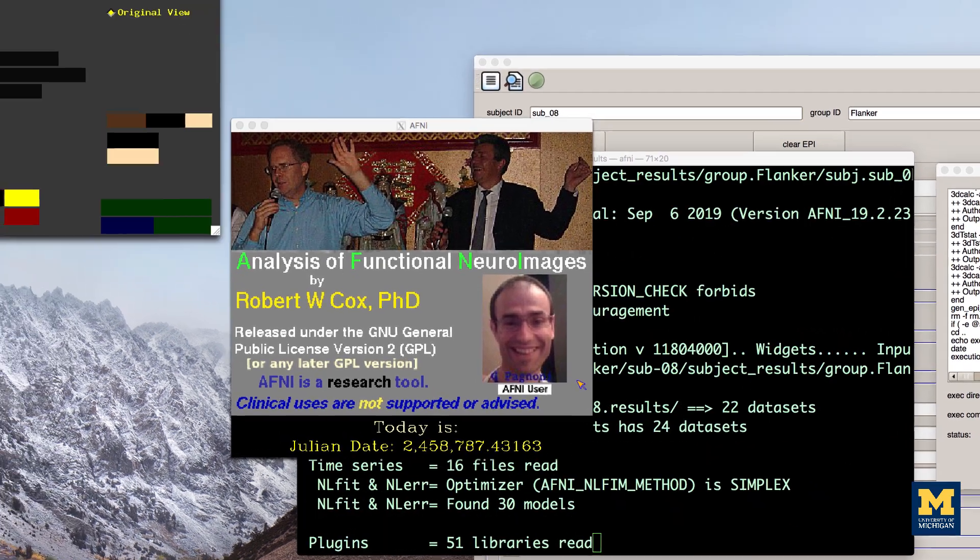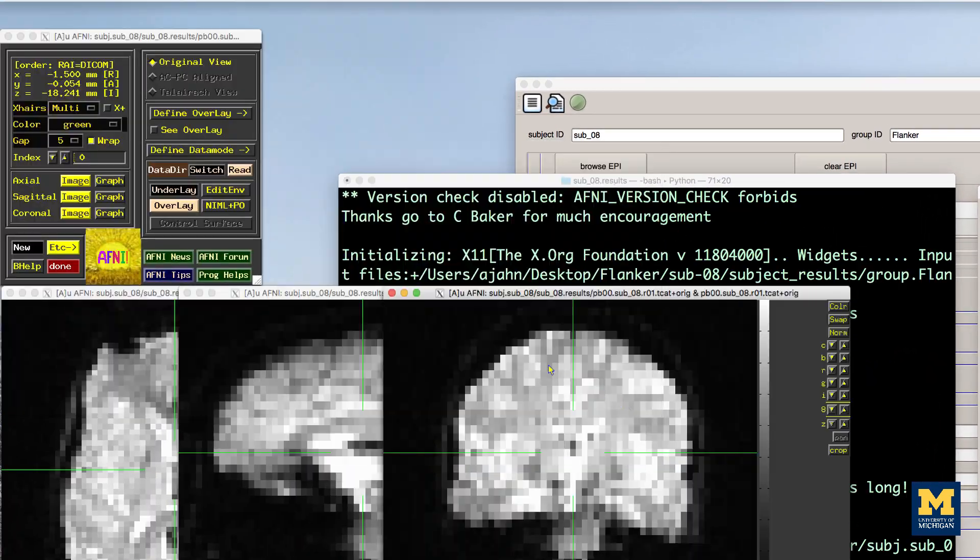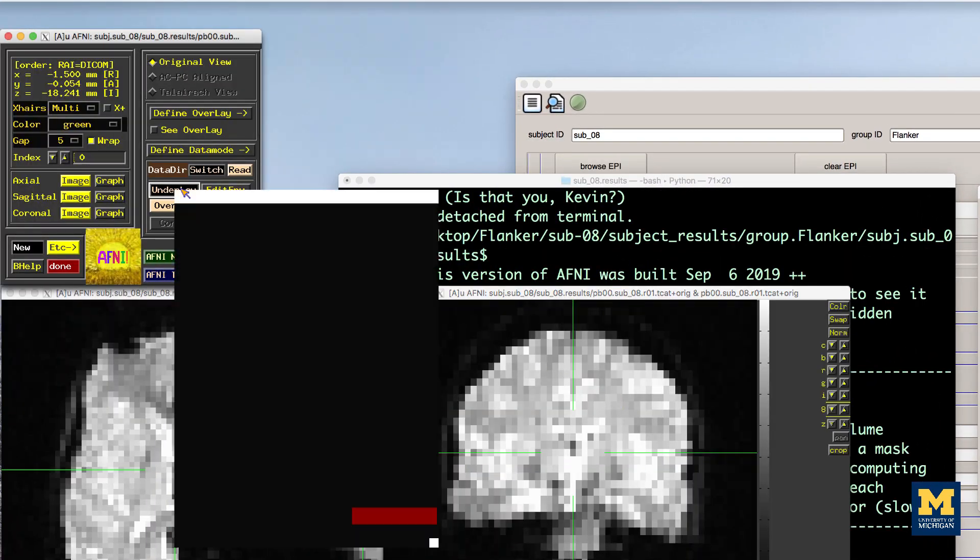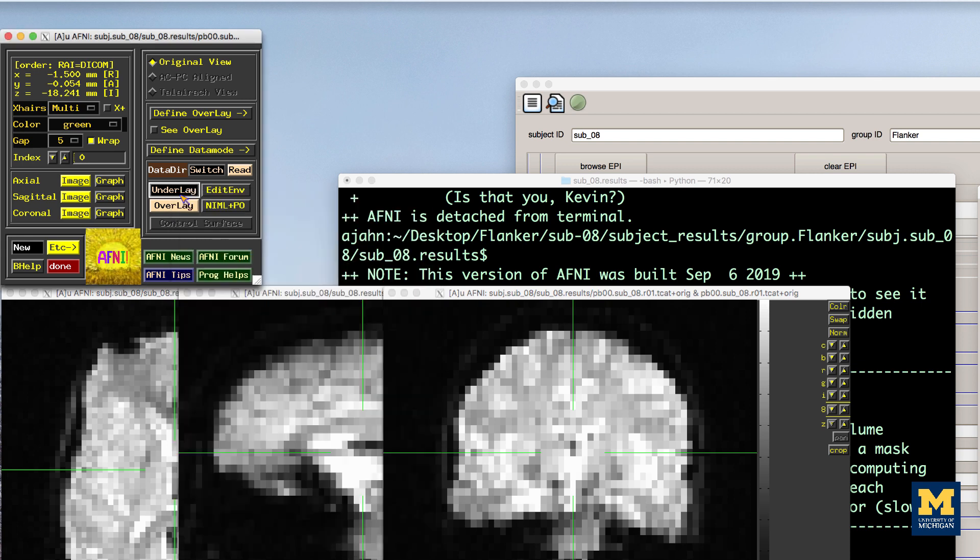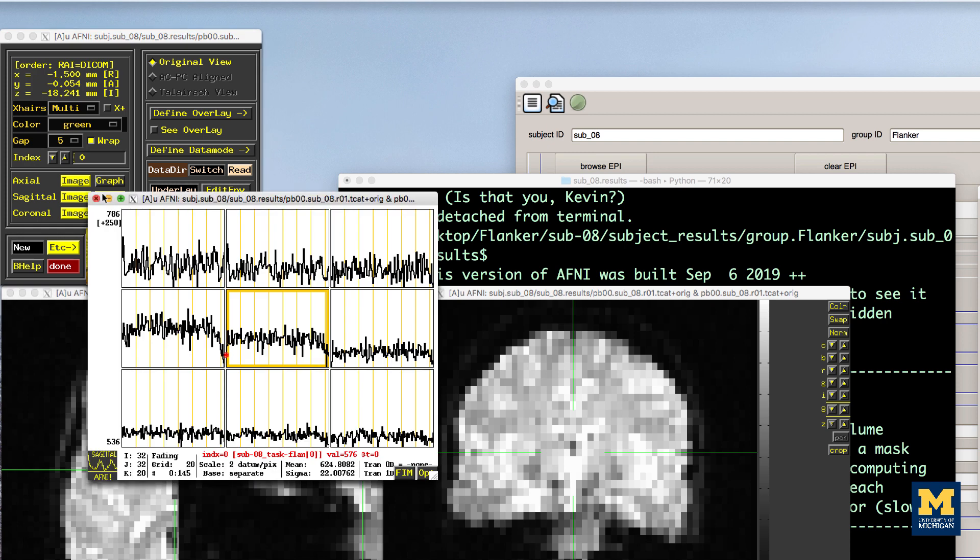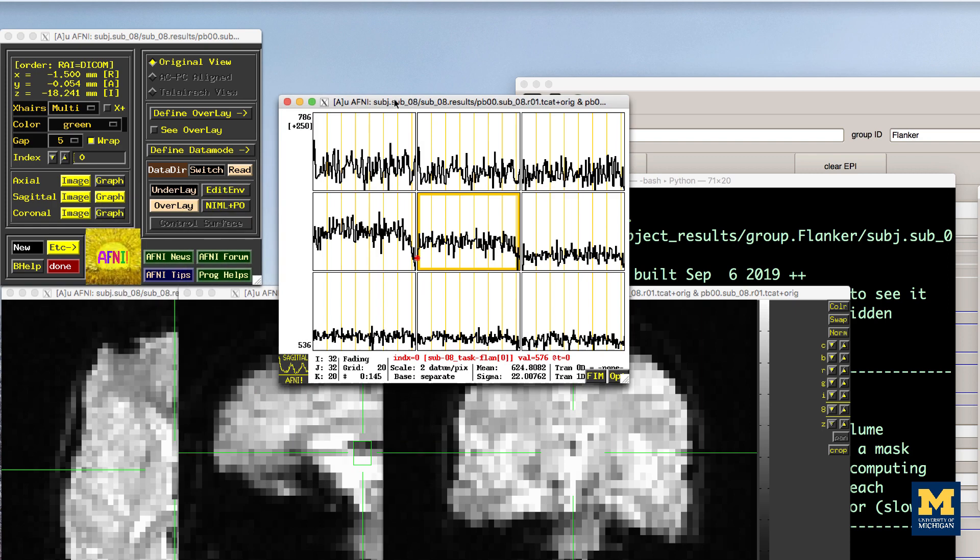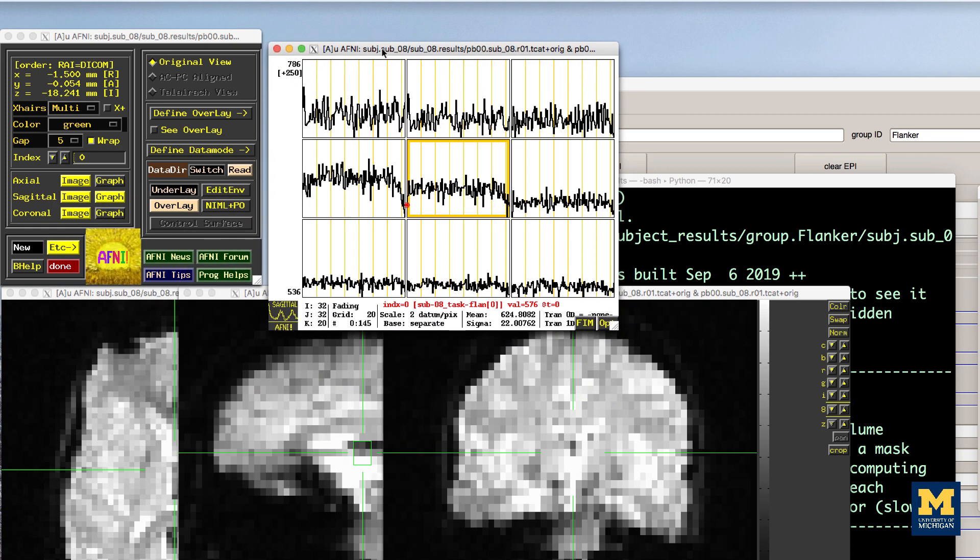Now open the AFNI GUI. Click the underlay button and left click on the file pb00.sub_08.r01.tcat. Then click on the graph button next to any of the axial, sagittal, or coronal views to view the time series. Since the initial volumes had already been discarded before the data was uploaded to OpenNeuro, all of the time points are of the same relative intensity.